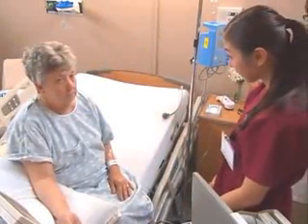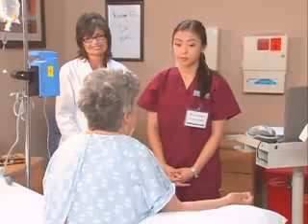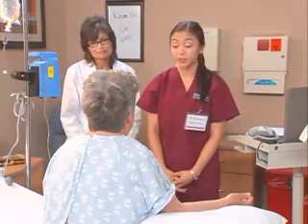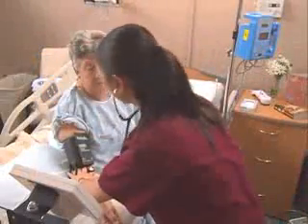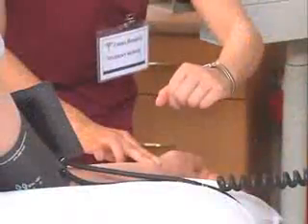Do you still feel okay? So far, so good. All right, now I'm going to check your blood pressure and your pulse again. At this rate, I'm going to be a real pro at this stuff. You sure are. Okay, thank you.